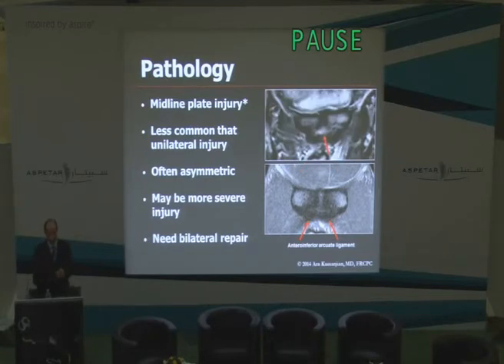And you can see in these images, I apologize for the quality of the upper image. On the lower image, you can see this is an anterior inferior arcuate ligament, and it's a very anterior structure. And on a patient here, you can see that there's actually disruption of that, and you have this fluid cleft. So it's actually like that horizontal line that I showed you. It's that superior cleft, but it's crossing the midline. I think it's important to appreciate this is actually involving that midline component.